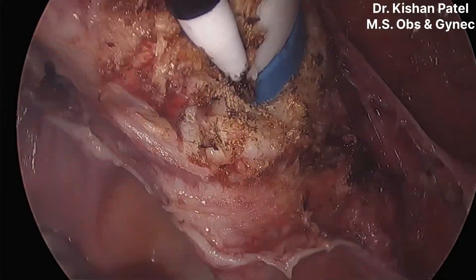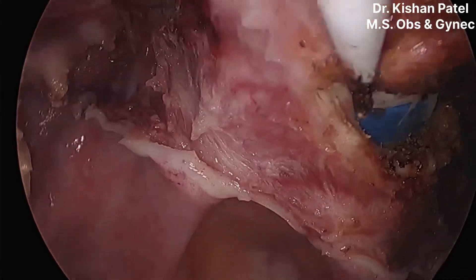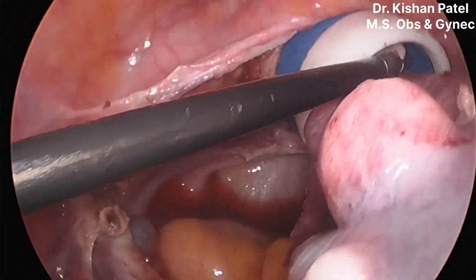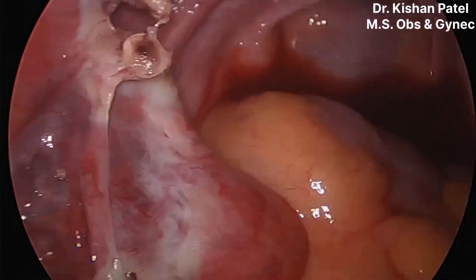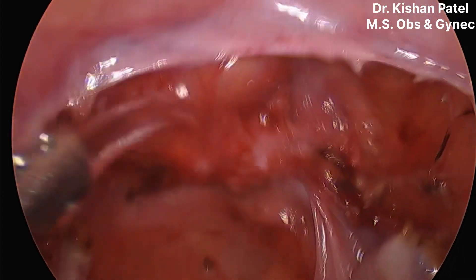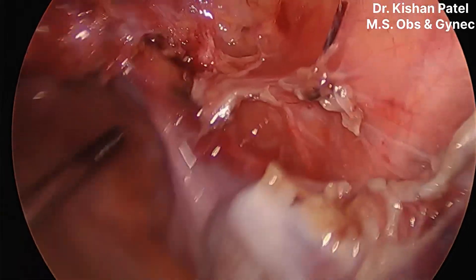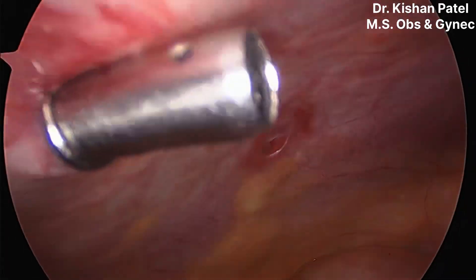As the cervix is large and hypertrophic in this case, we are completing the colpotomy. To save time, we put both fallopian tubes in and do specimen removal one by one. We have removed the uterus; vault is closed from below. We are washing the pelvic cavity. No active bleeding - I will remove the minor ports followed by major ports. Thank you so much for watching.